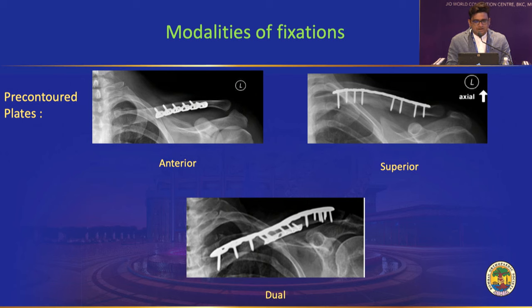So what are the modalities of fixation we generally use? We have seen plates being used. These are pre-contoured plates which can be attached anteriorly, superiorly, and even dual plating systems have been described.